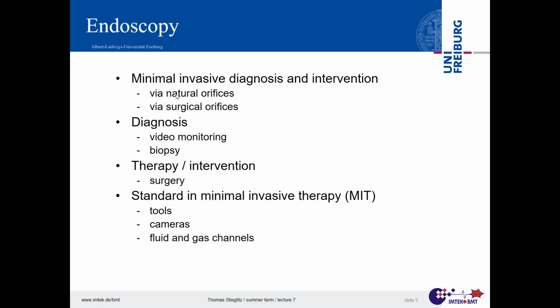And if we talk about all those beautiful endoscopes, we should memorize that our body is not empty. If we eat and drink something, that will stay somewhere. And if we want to go with an endoscope through the human body, we should keep that in mind, that it's probably not clean and tidied up, but that there is something on the way.